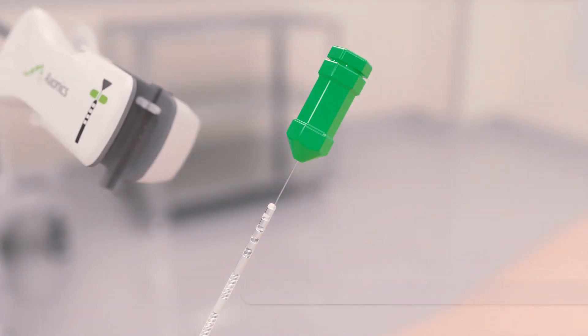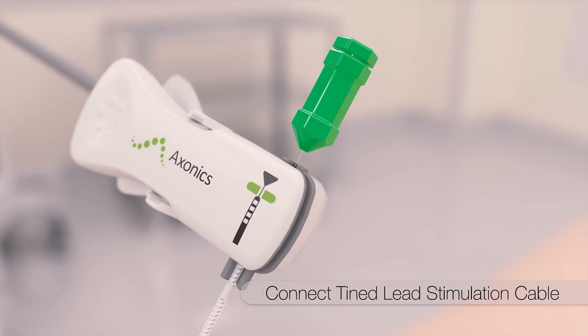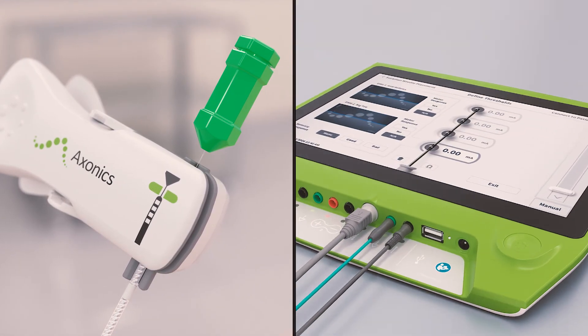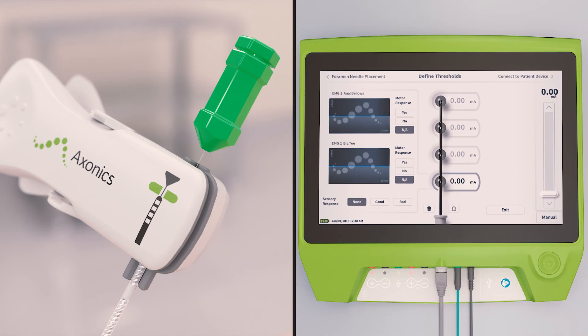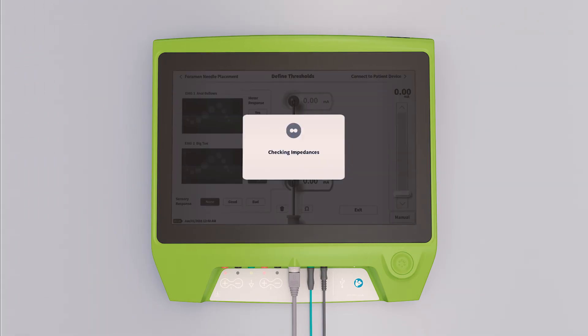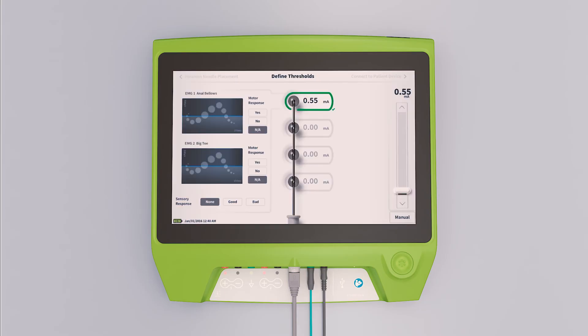The tined lead stimulation cable is clipped to the proximal end of the lead and connected to the clinician programmer. This feature of the axonic system eliminates the need for the physician to adjust the location of the test stimulation cable. The clinician programmer is used to check lead impedances before stimulation delivery. Each electrode is individually tested.